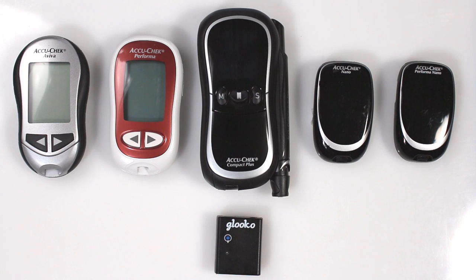AccuCheck Meters need to be in Data Transfer Mode in order to communicate with Meter Sync Blue. Each meter is slightly different.